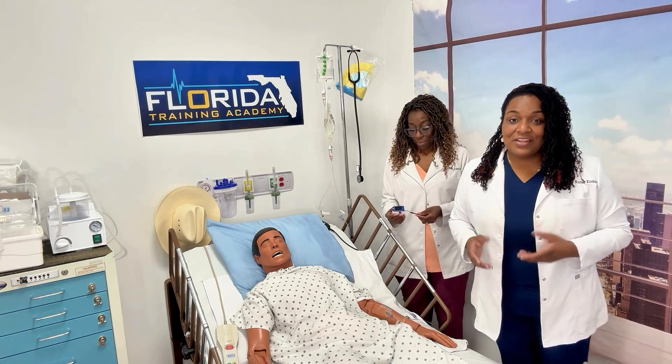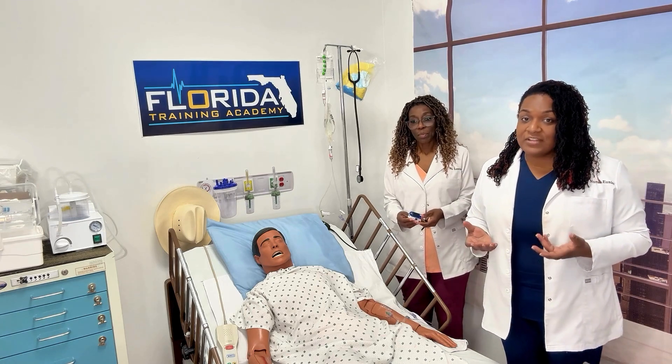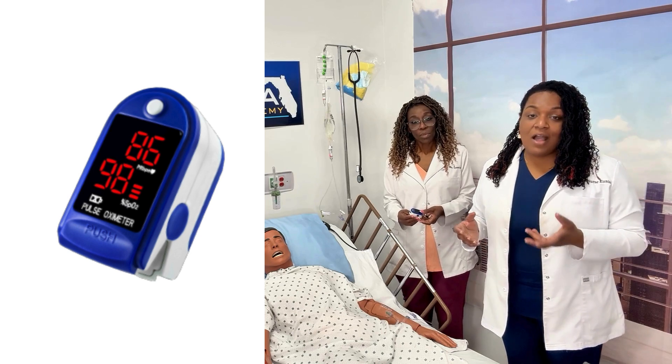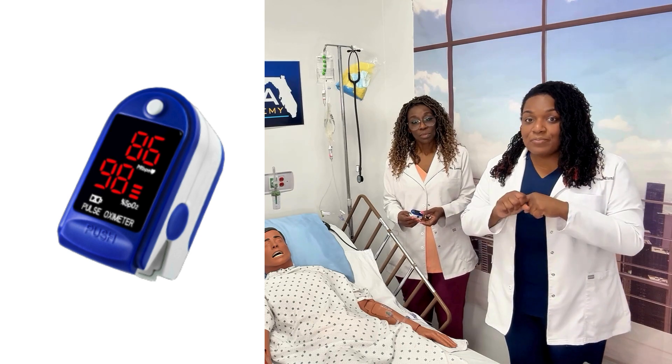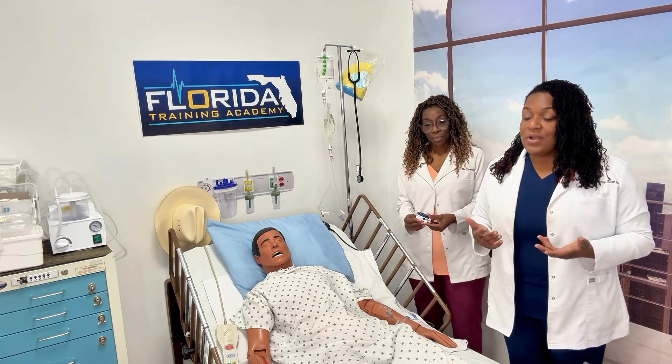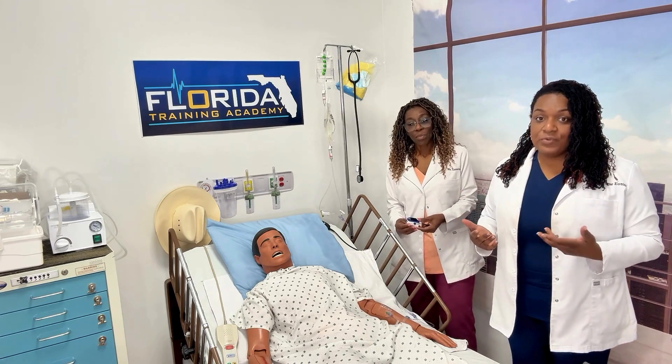Let's talk about oxygen saturation. The way that we determine a patient's oxygen level is by using a pulse ox, also referred to as a pulse oximeter. It's a finger probe that you put on your patient's finger, and it's going to tell you the patient's oxygen reading.